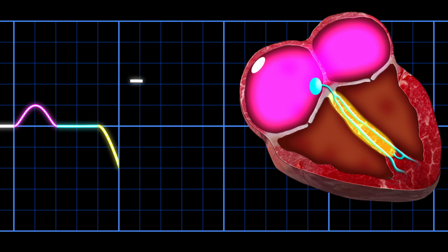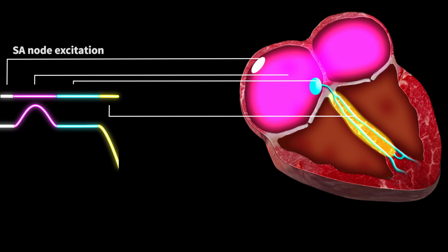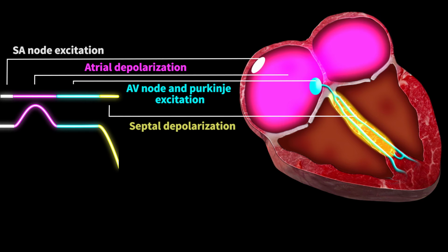SA node excitation, atrial depolarization, AV node and Purkinje excitation, septal depolarization.